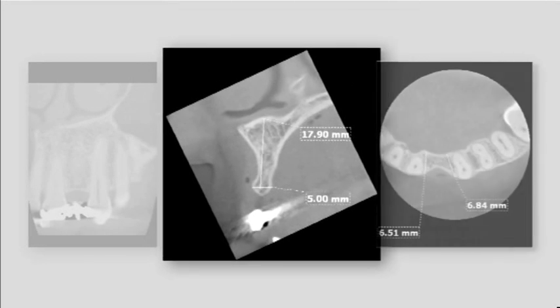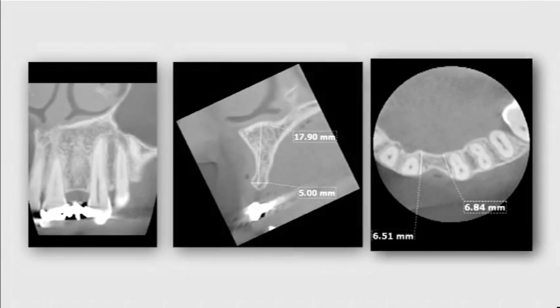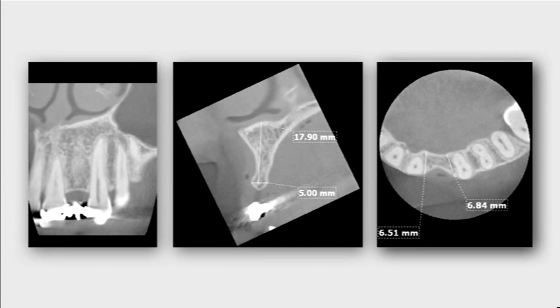The facial undercut is clearly visible in an occlusal view. In this situation, a triangular flap design will be used to avoid a vertical releasing incision on the mesial side of the flap and a potential scar line within the aesthetic zone.